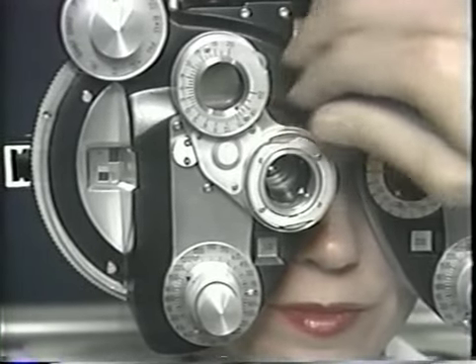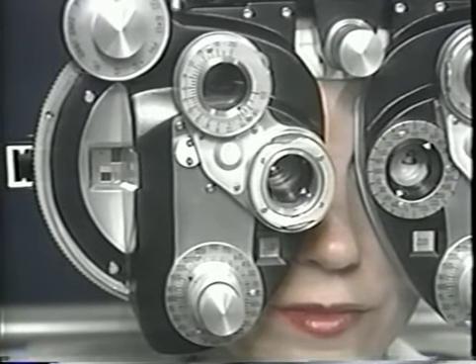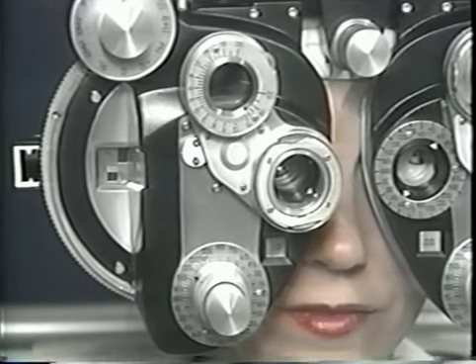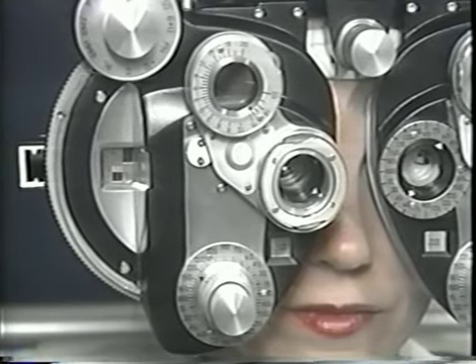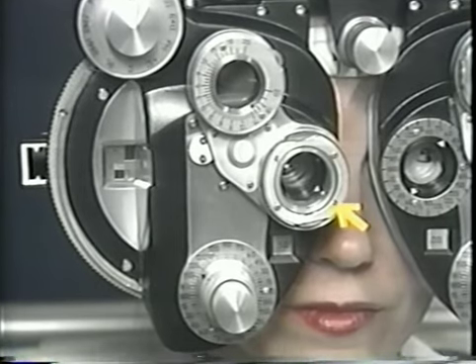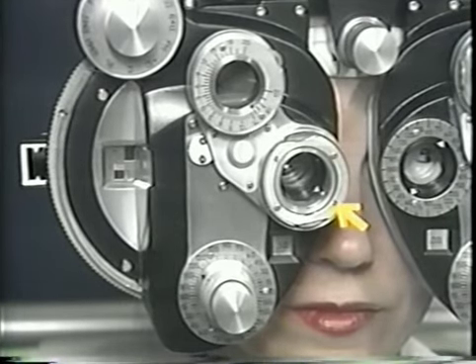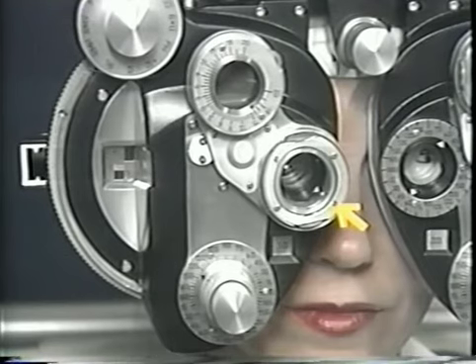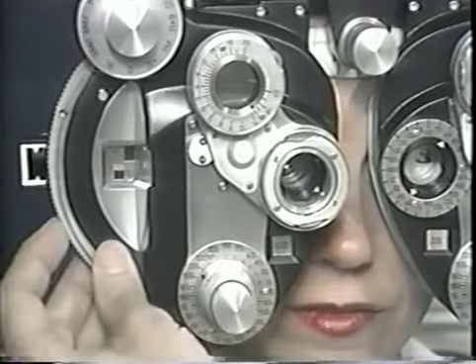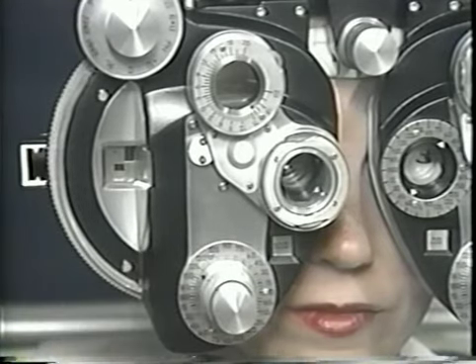Good. Again, the cross cylinder is left in the preferred position and cylinder power is added or subtracted in accordance with the position of the cross cylinder axes. Here, the plus cylinder axis of the cross cylinder is aligned with the plus cylinder axis of the phoropter, indicating the need for more plus cylinder power. 2 clicks of cylinder power are added, and the sphere is moved 1 click in the minus direction.